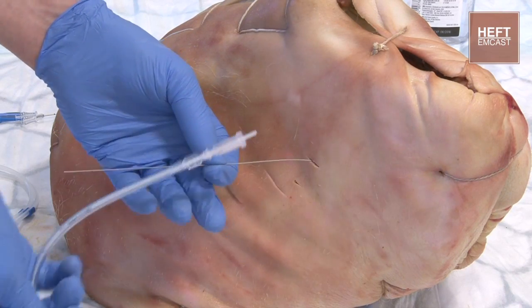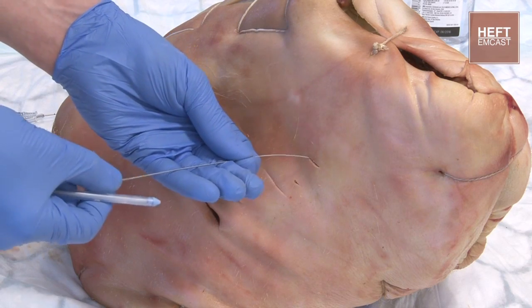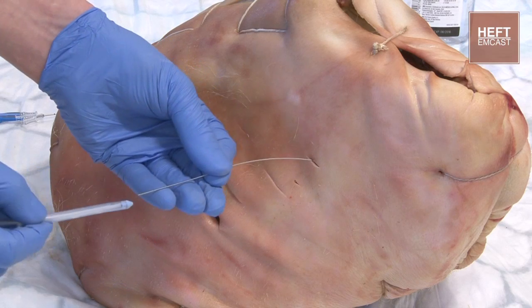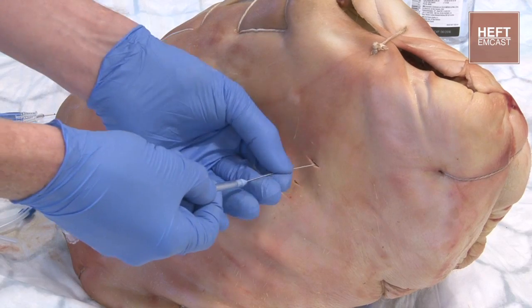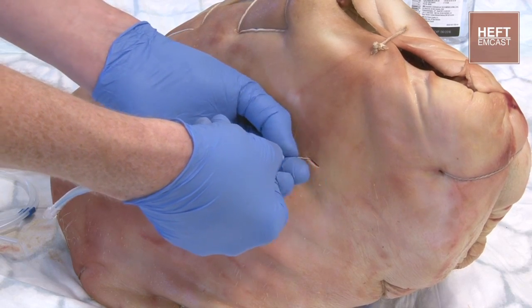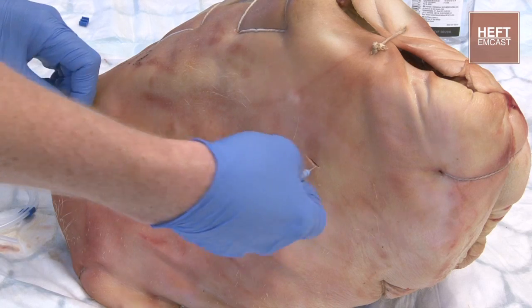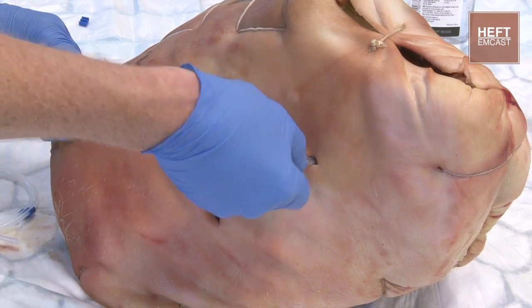Then we'll get our drain, which has still got the stylet coming down the middle of it. We're going to advance this until all the eyelets are actually in the intrapleural space. Advancing that through, making sure you don't let go of the guide wire. When it's coming out the other end of the tube, hold onto that firmly and advance the drain down the tracks you've just created.